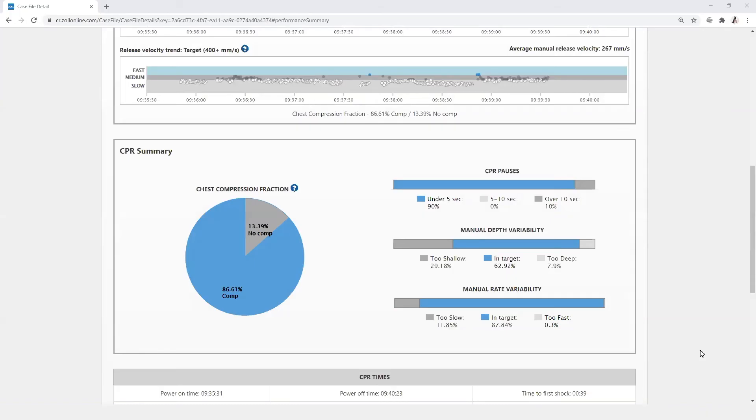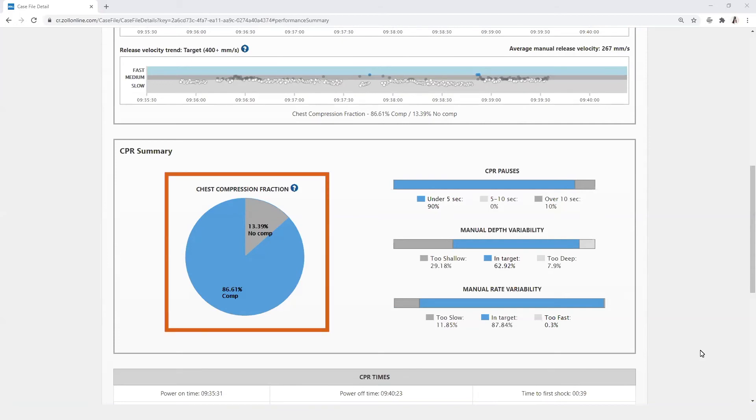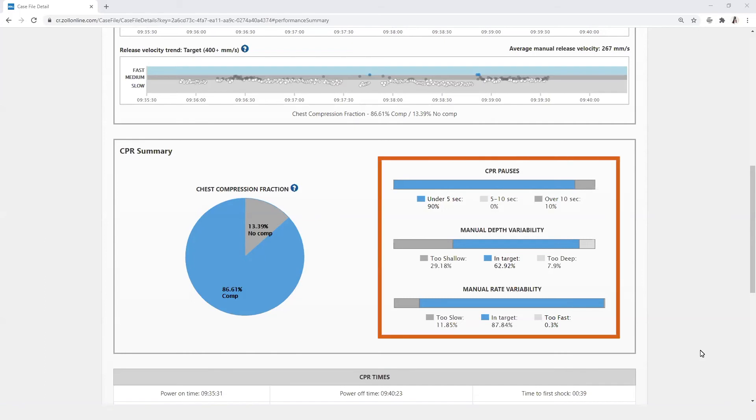The CPR summary displays the chest compression fraction represented as a pie chart, illustrating the percentage of time compressions were performed and the percentage of time compressions were not present. CPR pauses and manual depth and rate variability are broken down in graphs on the right.